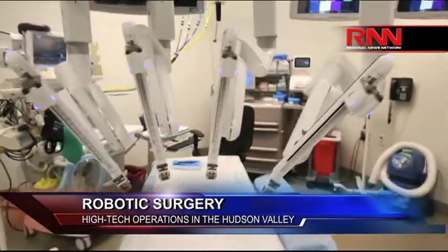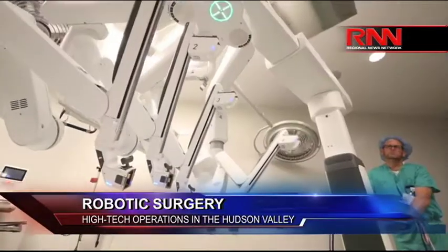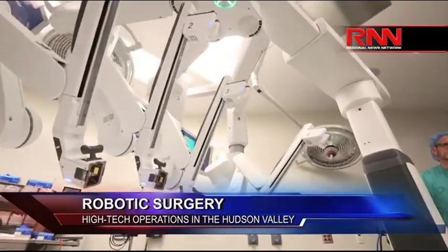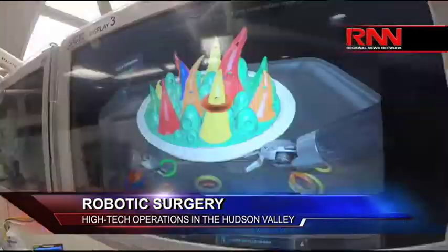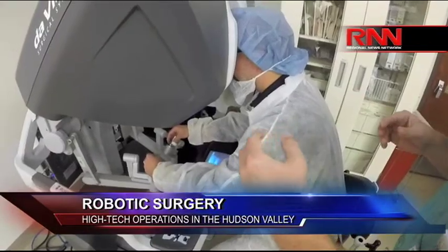Definitely. When you're talking about recovery times of 2-3 months versus a few days, that's a huge leap in limiting pain and the amount of time that goes into getting back into your normal life. And that's really what the surgeons will tell you is their main goal, to cut down that impact to the patient. And that's where you get into the minimally invasive aspect of this.